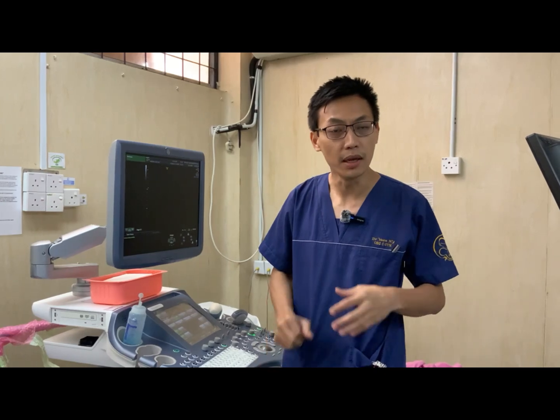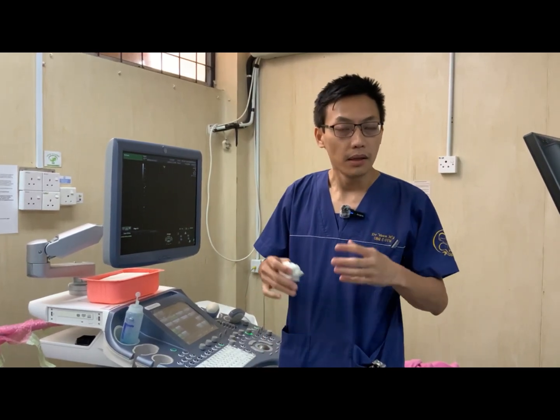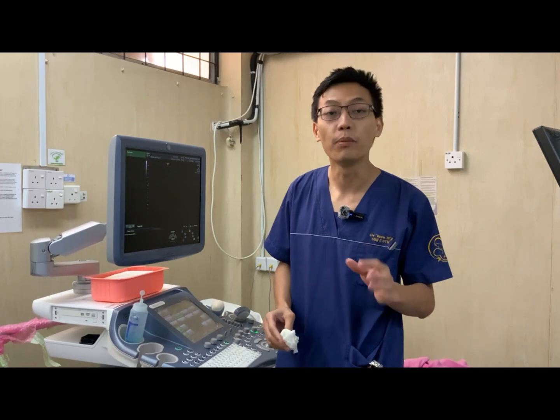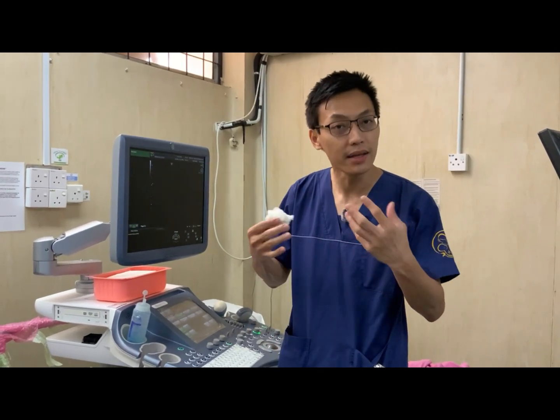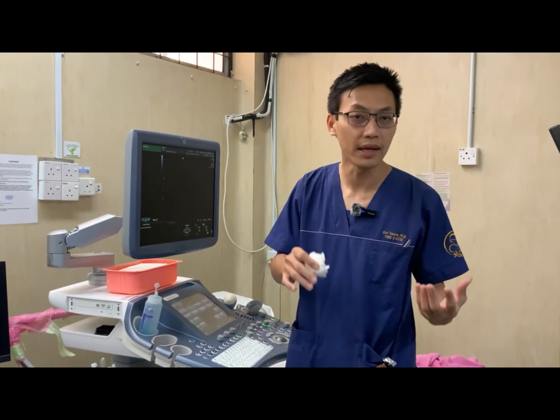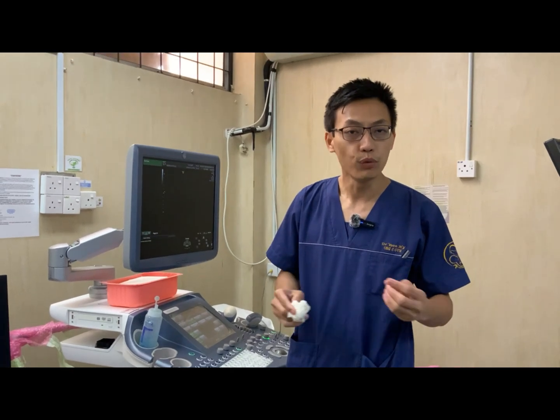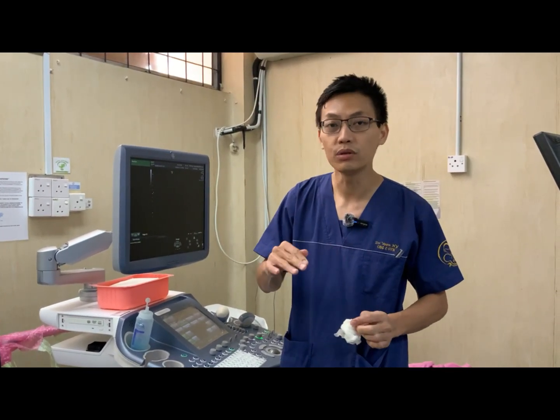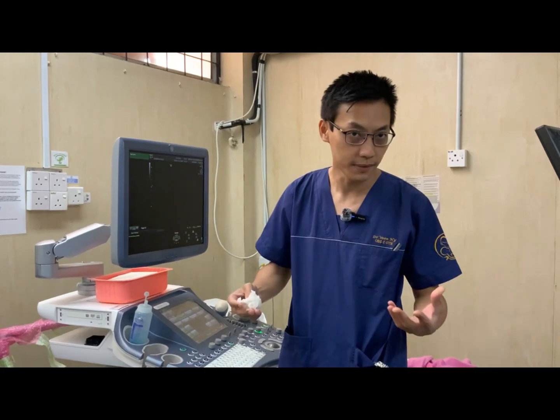So that's how we assess for intra-abdominal bleeding in an emergency setting. These areas, in the pouch of Douglas or the Morrison's pouch, are the most dependent areas when patients are sitting or lying down, and therefore fluid or bleeding tends to collect in these areas. So it's important to just focus and have a quick look at it.